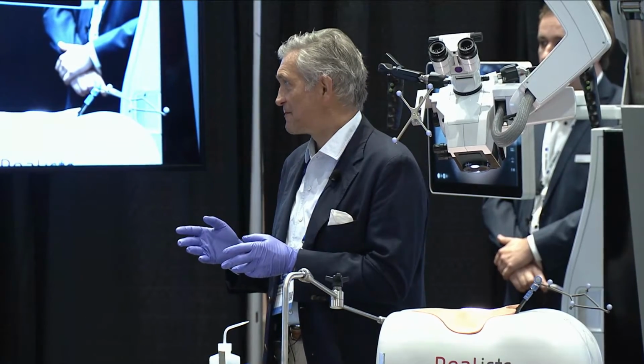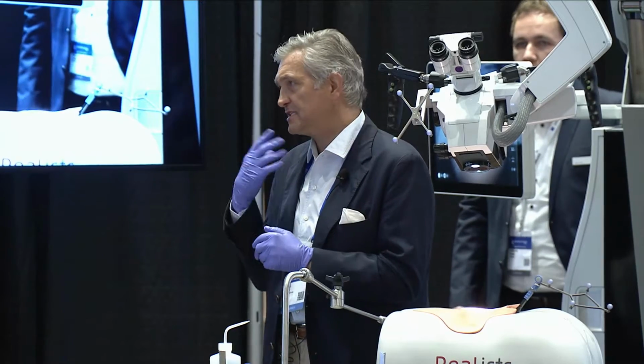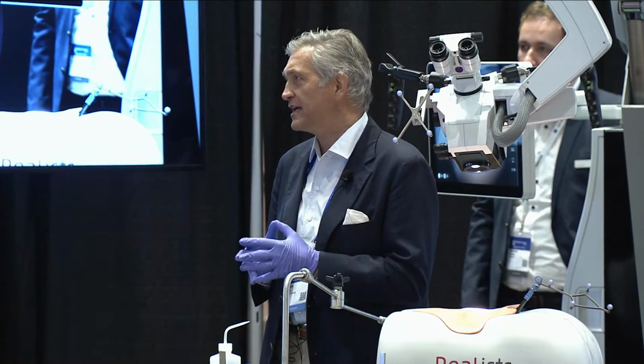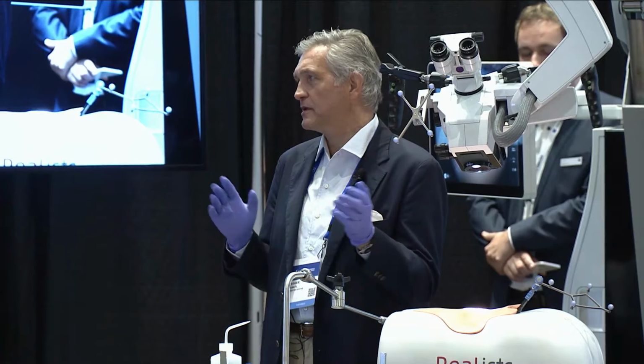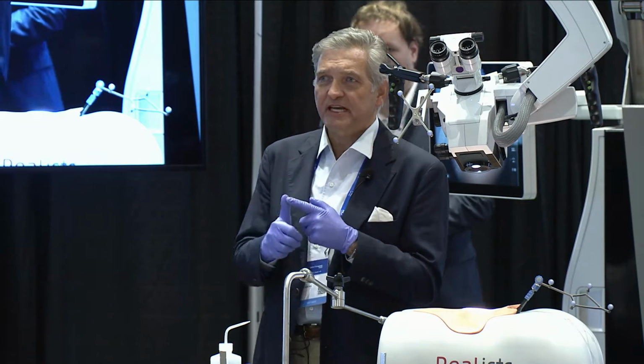Even for open surgeries, Dr. Hartel? Yeah, for open and for MIS. Even ACDFs now, we navigate pretty much everything. The only thing we don't navigate is lateral surgery, because there's so much motion when you put the cages in that it's not very accurate. For everything else, we navigate. Yeah, so navigation is number one.